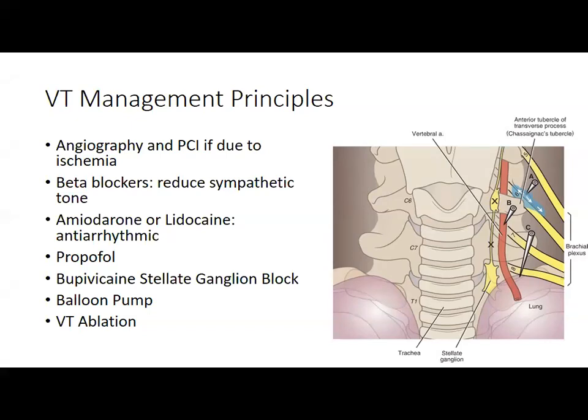One thing that any of you doing nights in the CCU will experience is the joy of having a patient admitted maybe a couple days prior for VT. They get them calmed down, maybe they revascularize them, and they've got them on lidocaine, they've got them on all this stuff, and they're super quiet. And they say, okay, we're going to take them for an ablation tomorrow morning. And they say, okay, stop the lidocaine, stop the amio, stop it all at like 6 o'clock. And so all the lidocaine starts to wash out. And the reason they do that is they need to be able to see the VT when they're doing the ablation. So 8 o'clock rolls around, they're starting to get some PVCs. 10 o'clock starts to roll around, they're starting to get some non-sustained VT.